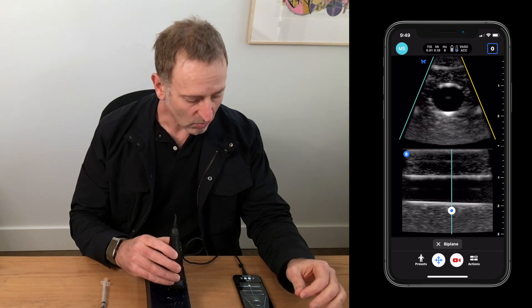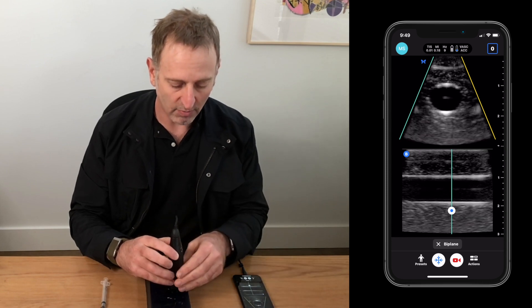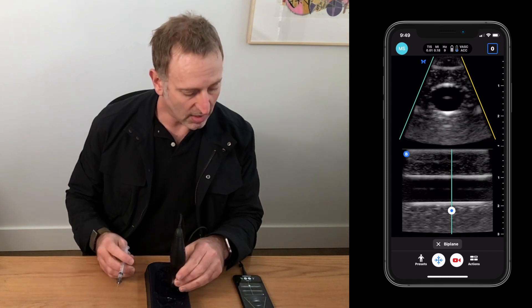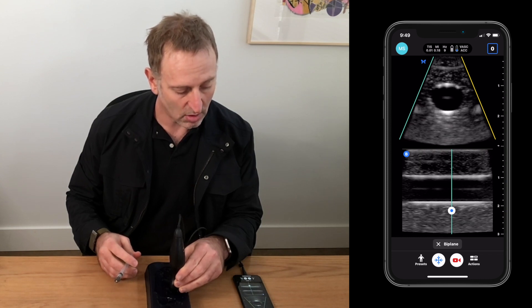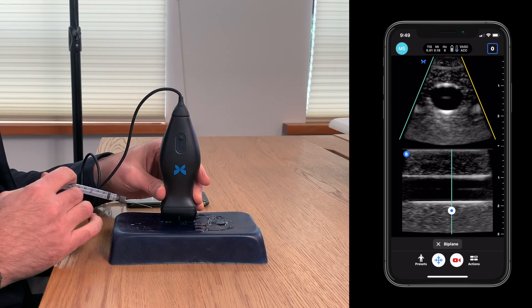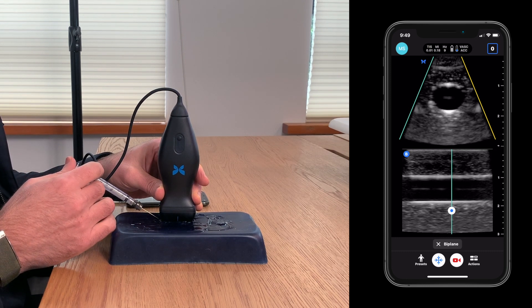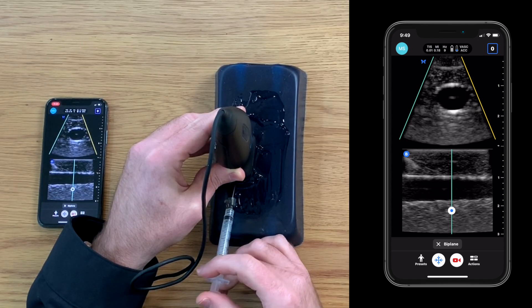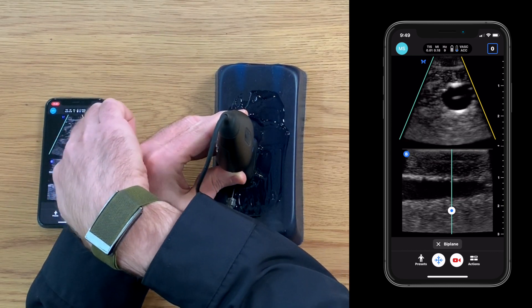Biplane is really intended for in-plane procedures, and the resolution on the bottom image is optimized for an in-plane needle insertion. If we look at how this appears with a needle insertion, we'll get a good image of the target vessel in a long axis on the bottom, and we can see we're centered into a short axis image on the top. As I insert the needle along the blue dot side of the probe, we can see the needle insertion beginning on the bottom image.